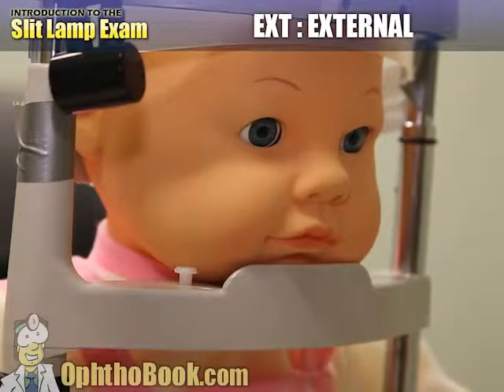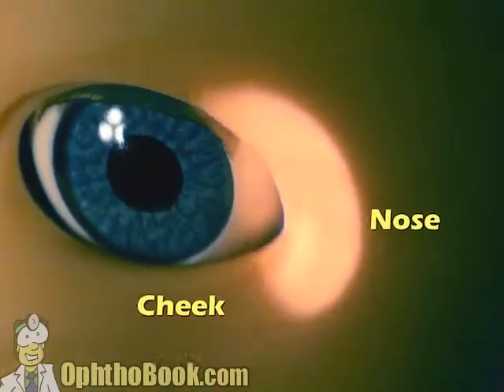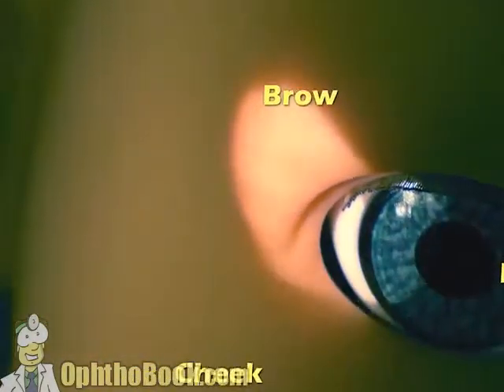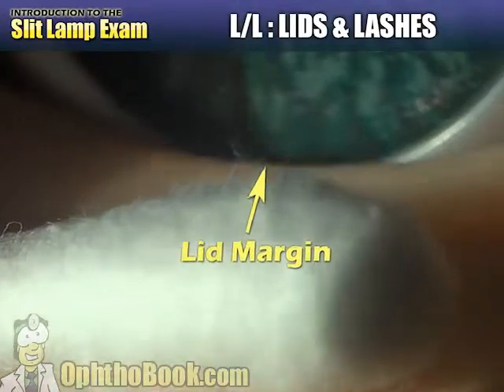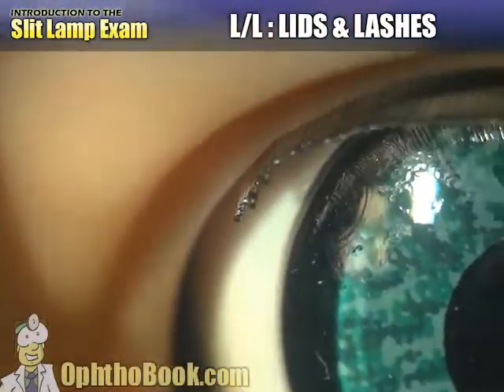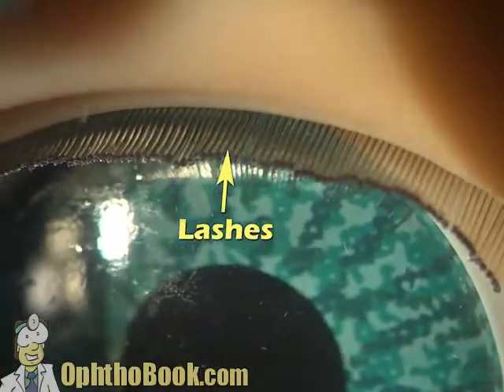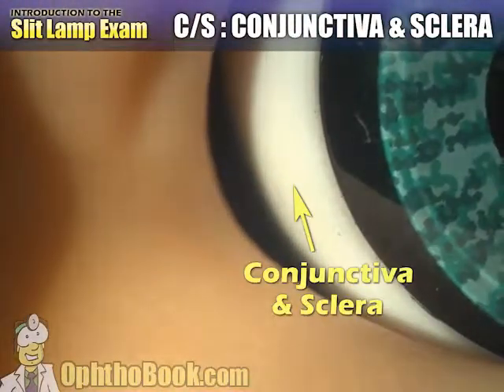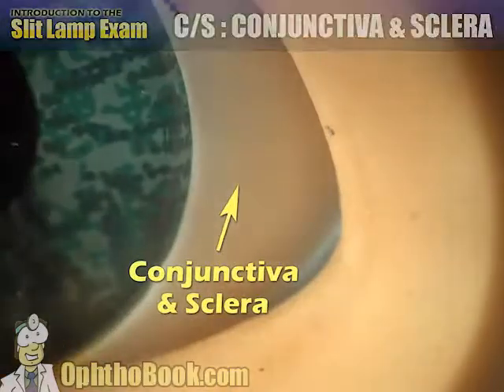We always start with the external eye: we look at the cheek, the nose, the brow — things around the eye that might cause ocular problems or be related. Moving on to our lids and lashes, we always look at the lid margin and the lash line. Then moving on to the conjunctiva and sclera — the white part of the eye — white and quiet here.